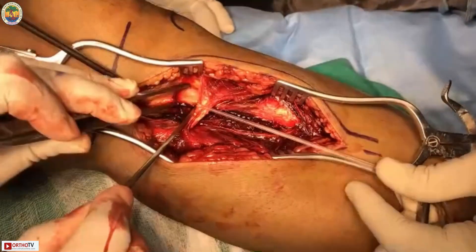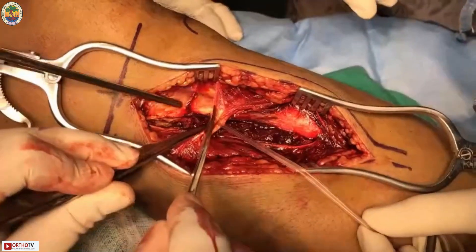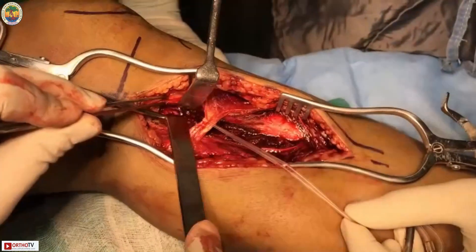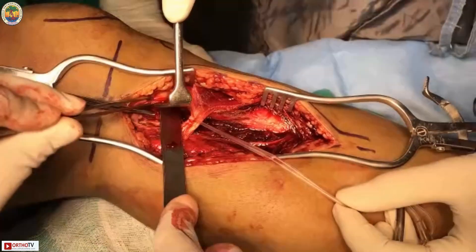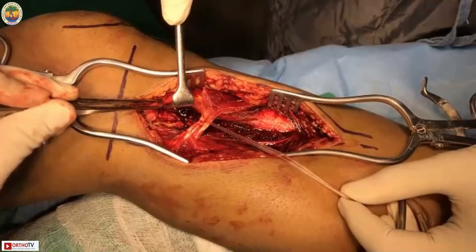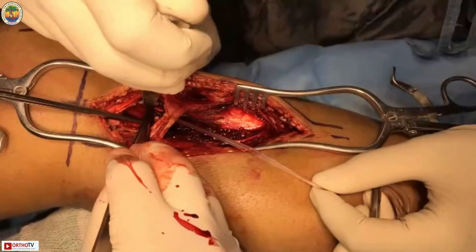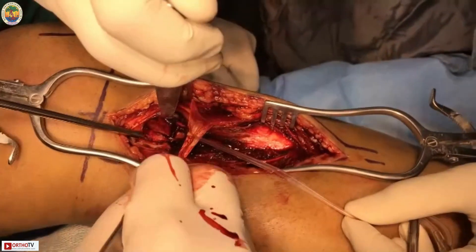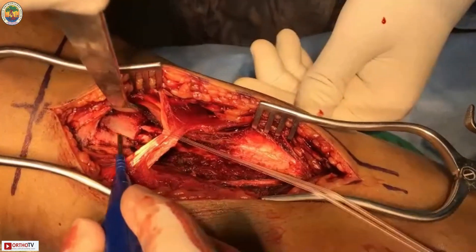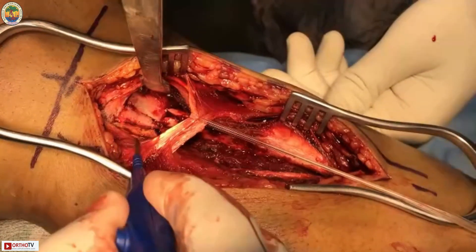The fracture lines are now visible — there is a loose piece of fracture fragment. The medial collateral ligament attachment is elevated anteriorly, giving easy access to the posterior half of the tibial condyle. The distal and proximal fragments are identified. There is also a fracture line in the sagittal plane, showing the anterior and posterior portions of the tibial condyle.